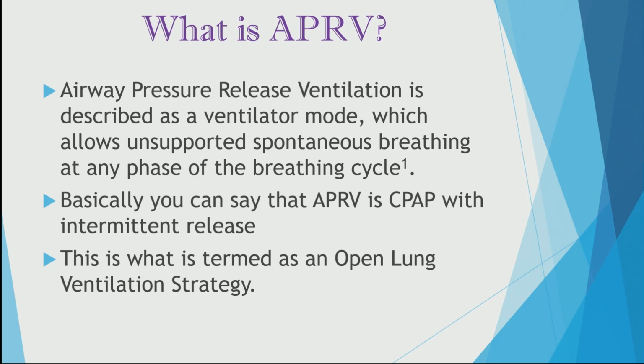In the medical community, this is what most people call an open lung ventilation approach. Now we understand what it is: APRV is being used to open the lung and to recruit alveoli. So it's called an open lung ventilation strategy.